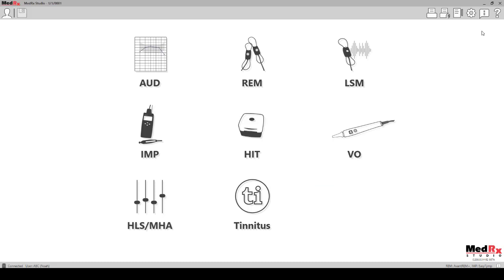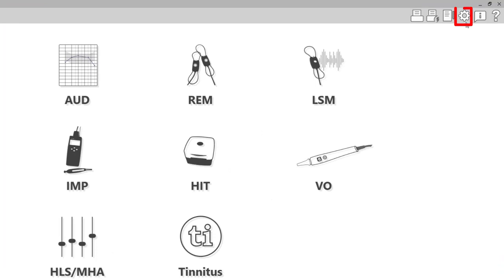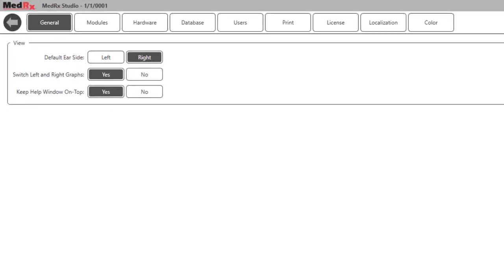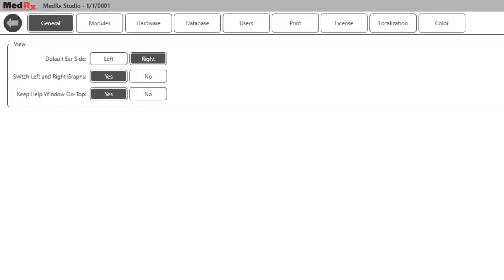Once the software is launched, please select the settings icon in the top right corner of the screen. This icon will allow you to set the overall operation and view of the Studio software suite to your preferences. Please note, all factory default settings will be highlighted in black.